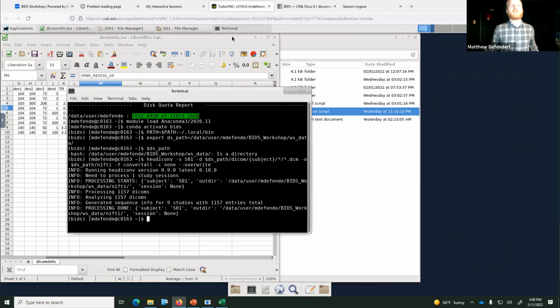Okay, so what I would say there is if there is truncation, the dcm2niix tool, I think, goes in and finds out how many volumes there are supposed to be. So just removing the DICOMs for the specific volumes that you don't want, I don't think that's going to work because I think it'll throw an error.